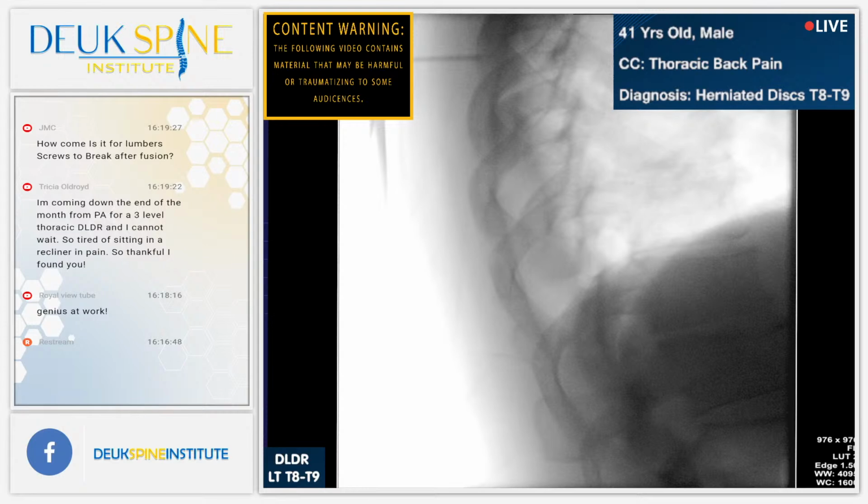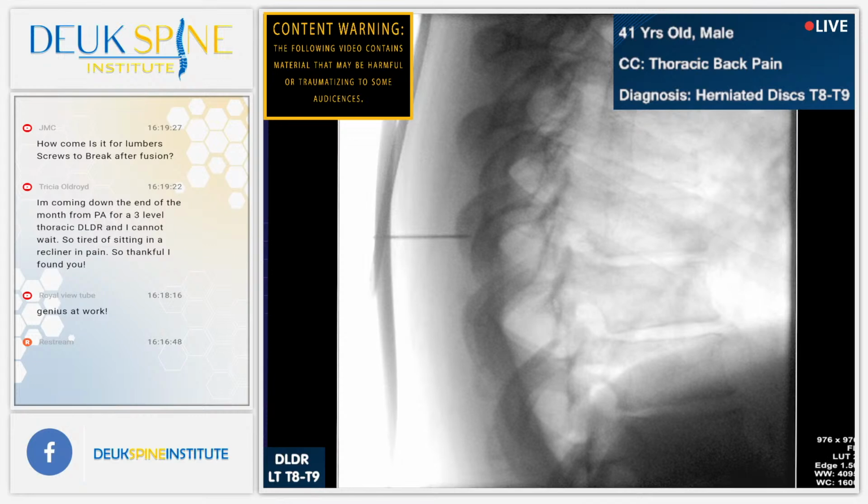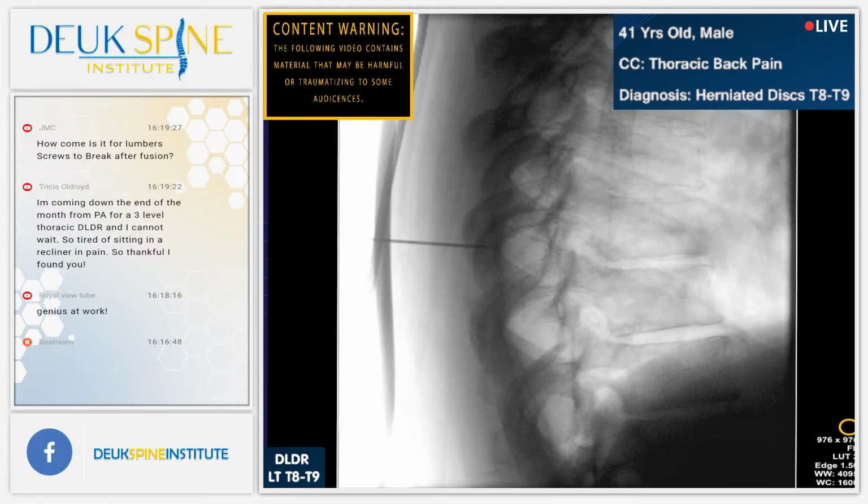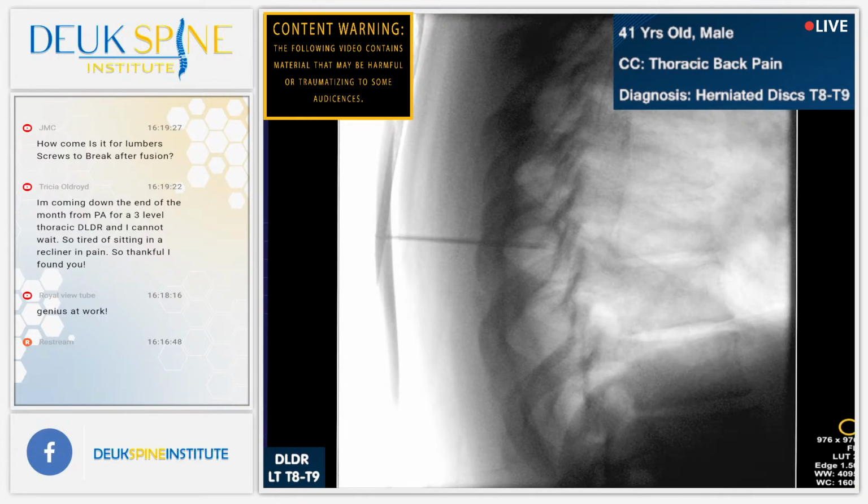All right. That looks pretty good. You're doing great. Lay still, okay? Now I gotta make my way down to the T8-9 disc. Don't move. Don't move. Keep your head still. Head still. Head still.